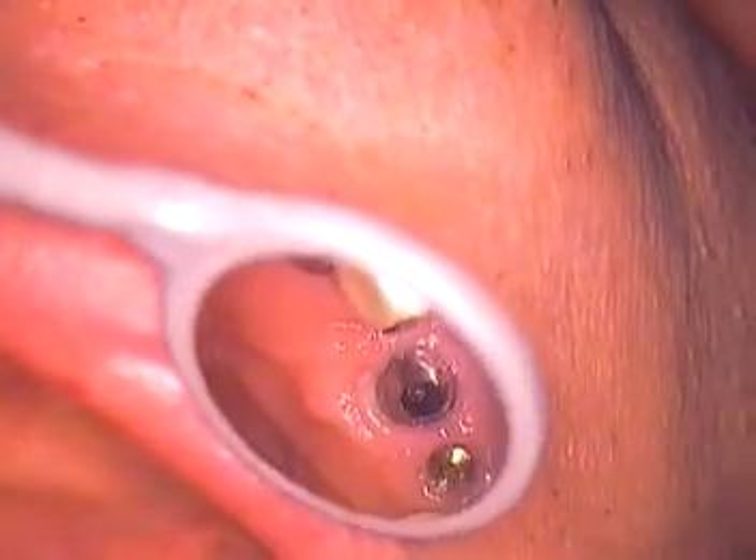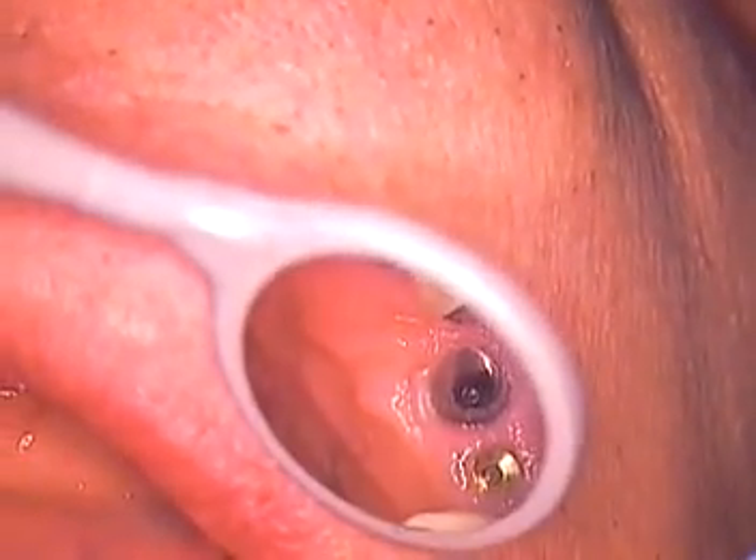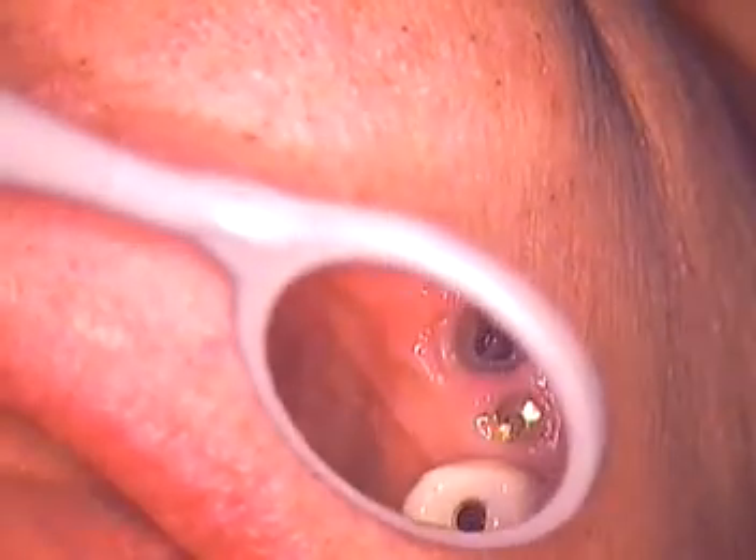Now the right side — I was watching the blanching go away, and it's just about all gone. It's all pink now, see? So I'm going to go back in and just hand-tighten a little bit more now. It's down all the way. That's great.